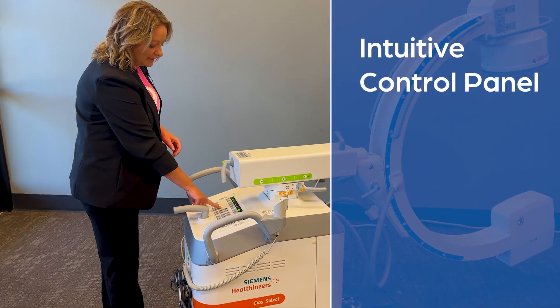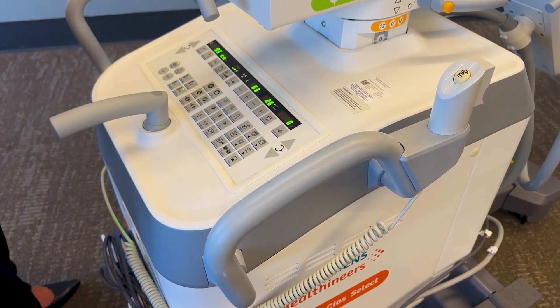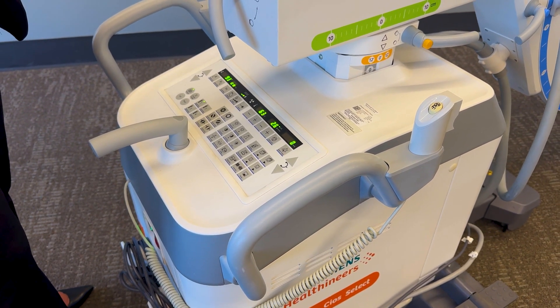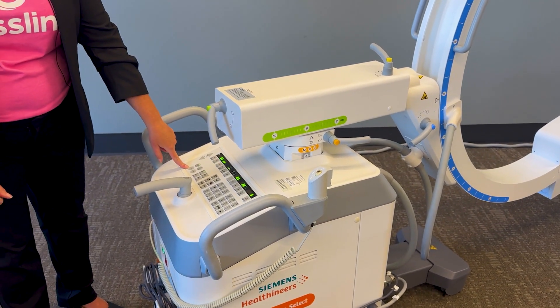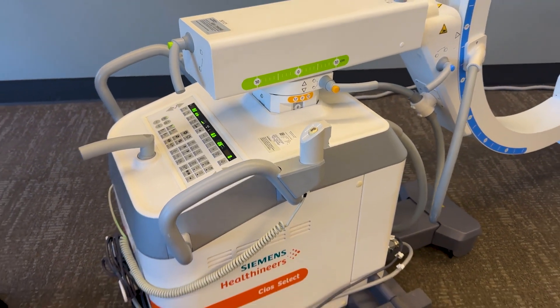You are able to easily change applications between four different presets to your facility's liking — such as ortho standard, extremity, or general. This machine also has the option for a vascular package, so you can have simple subtraction and road map vascular options on it.